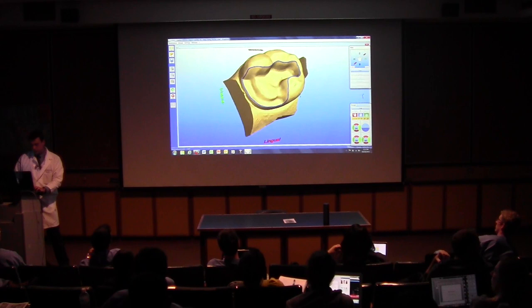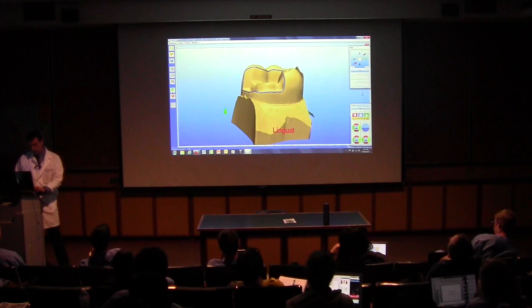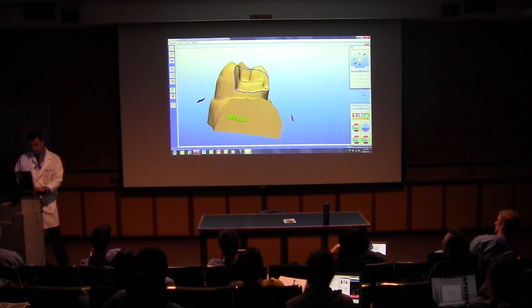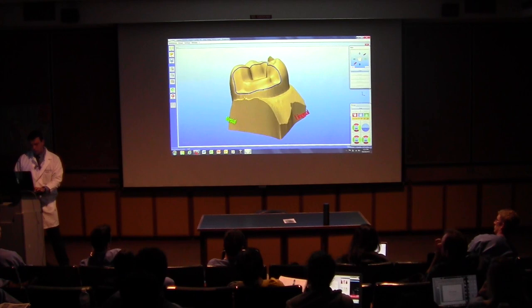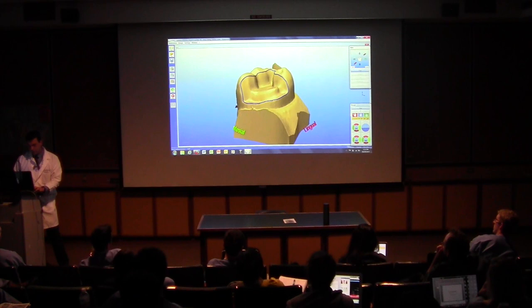Yeah, looks pretty good. I think you're ready to go. I think you can make an even smoother margin right here. You like that? What do you think? What about over here? Better now? Right here? Yeah, this is probably an impression problem, a 3D impression problem, but let's try to fix that. Why not? Better now? Yes. Are you guys happy?